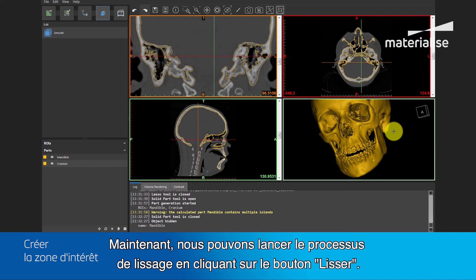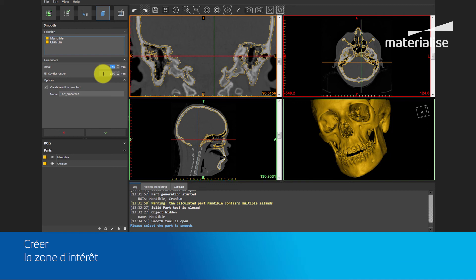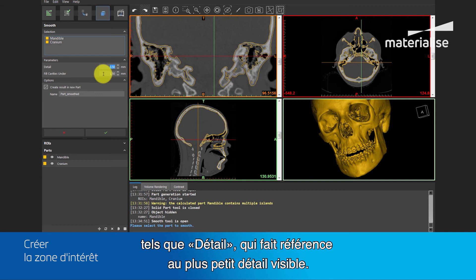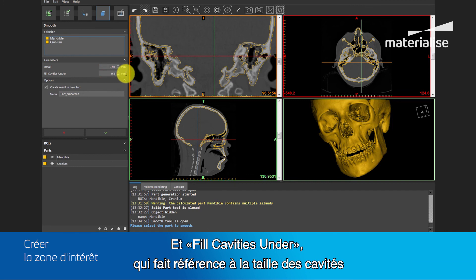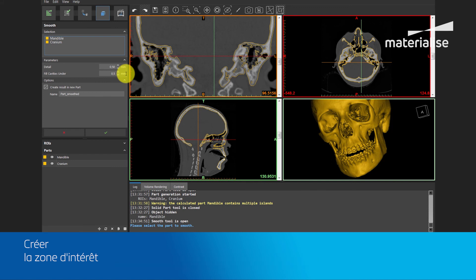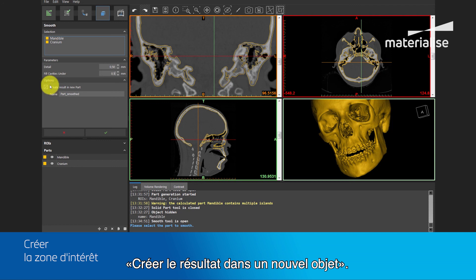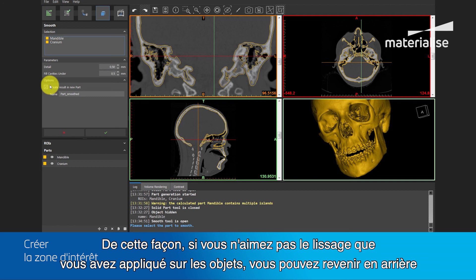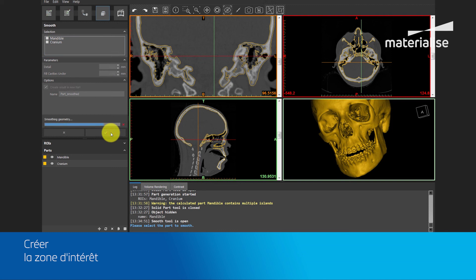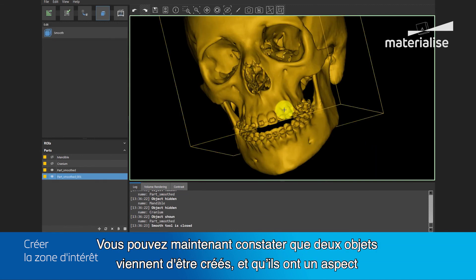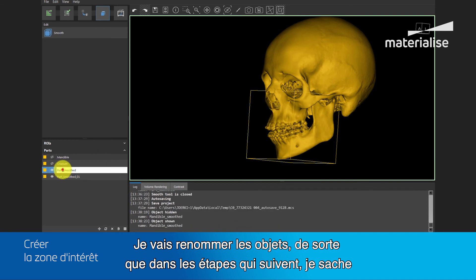Now we are going to initiate the smoothing process by clicking the Smooth button. After selecting the part, we can give values to different parameters, such as Detail, which refers to the lowest visible detail — this we will set to 0.5 mm — and Fill Cavities Under, which refers to the size of the gaps that are filled after smoothing — this we also set to 0.5 mm. We keep the option 'Create Results in a New Part' on. In this way, if you don't like the smoothness you have applied on the part, you can go back and try with different values until you get the desired result. As you see now, two parts are newly created which have a much smoother appearance than the ones before. I will rename the parts so that in a later process I know which part is which.